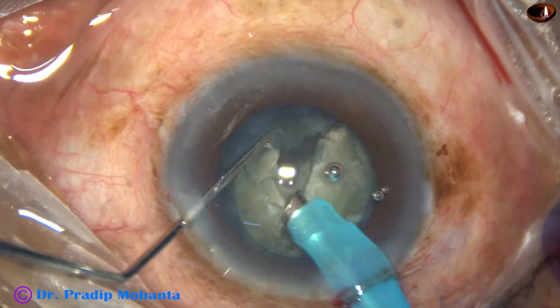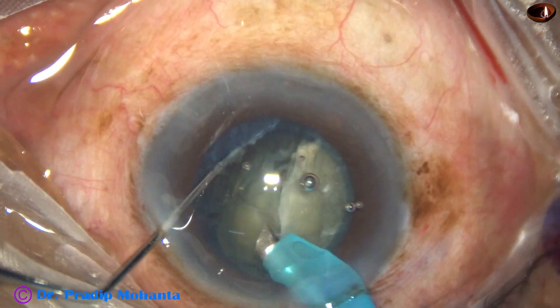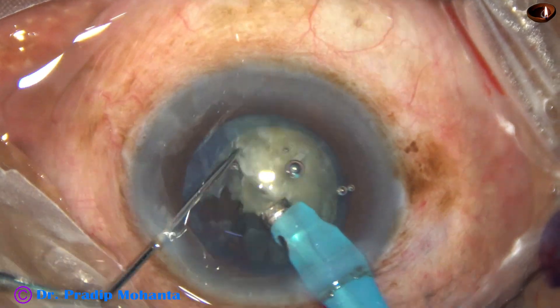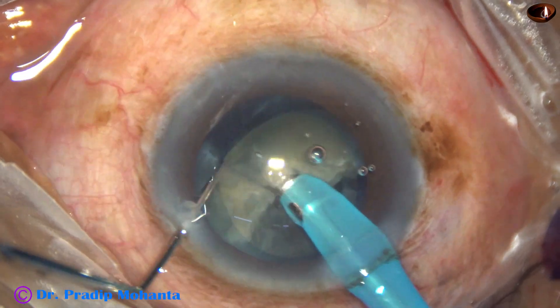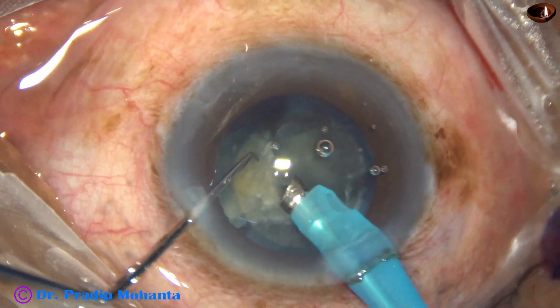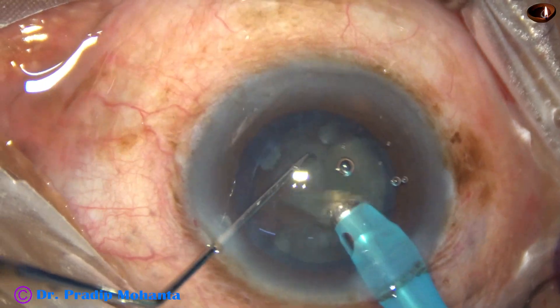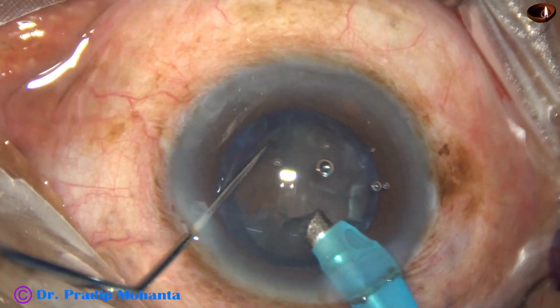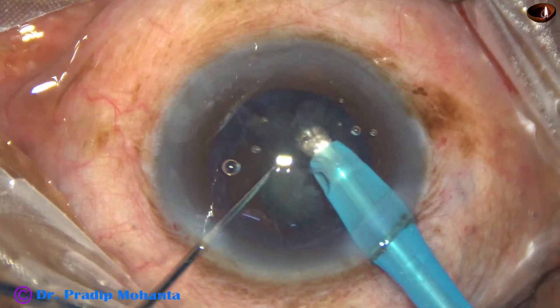The ultrasonic energy being used is 70 percent. Flow rate is 45 ml per minute. Vacuum is 450 mmHg. Towards the end of nucleus management, we decrease the vacuum and flow rate — vacuum is 300 and flow rate is 30.